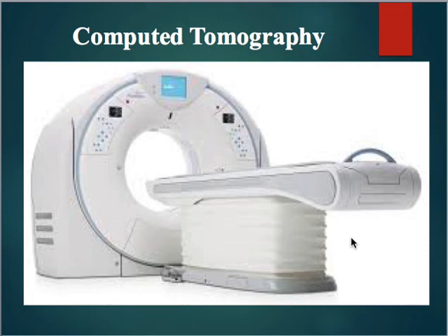Hi everyone, I'm here today to talk about CT scans. So a CT scan stands for computed tomography, which you can see at the top of the screen. Tomography itself is just a technique that we use for displaying a representation of a cross section, like an axial slice through the human body.